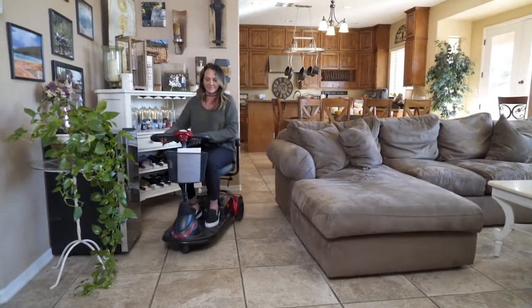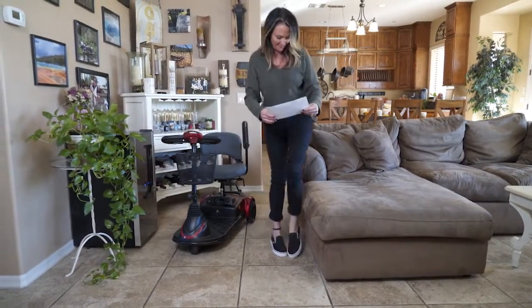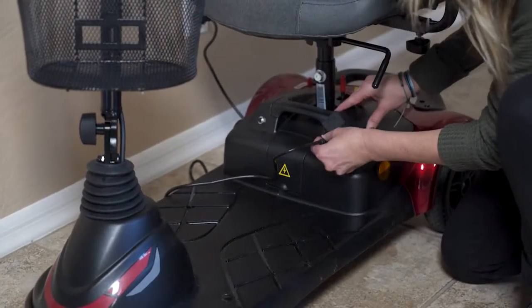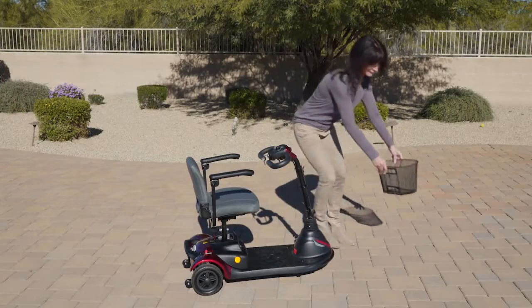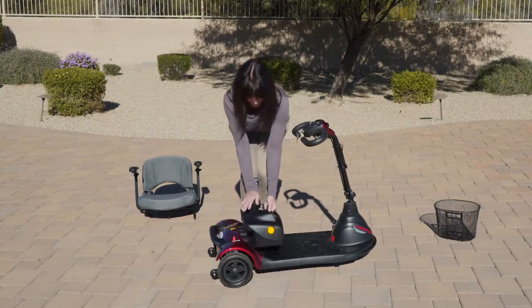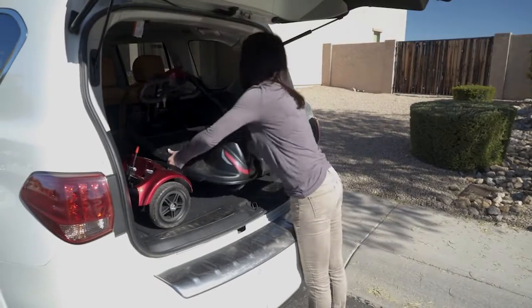With its super-efficient design, the EWM40 sets a new standard for both quality and portability and comes equipped with a heavy-duty removable battery pack, which can be charged on or off the scooter. The EWM40 also features a wireless electric connection that enables the scooter to be easily disassembled in just seconds to make transporting the scooter more manageable. This makes it a breeze when you need to pack your scooter up for traveling.